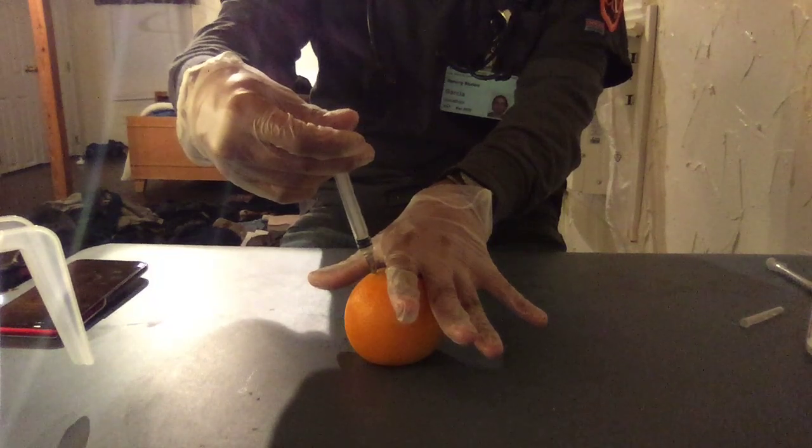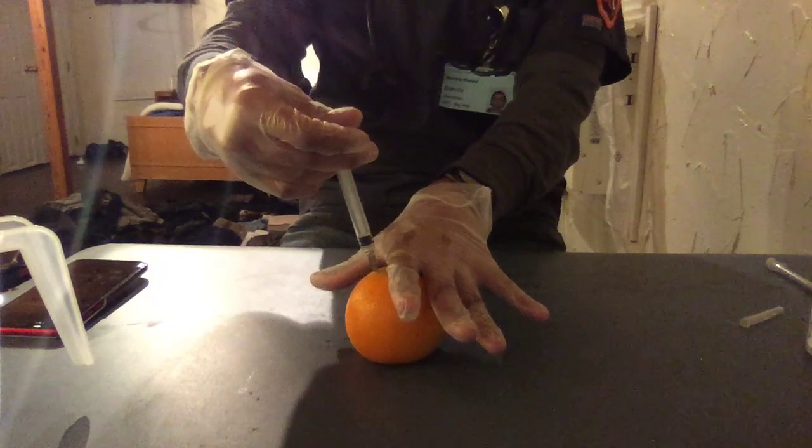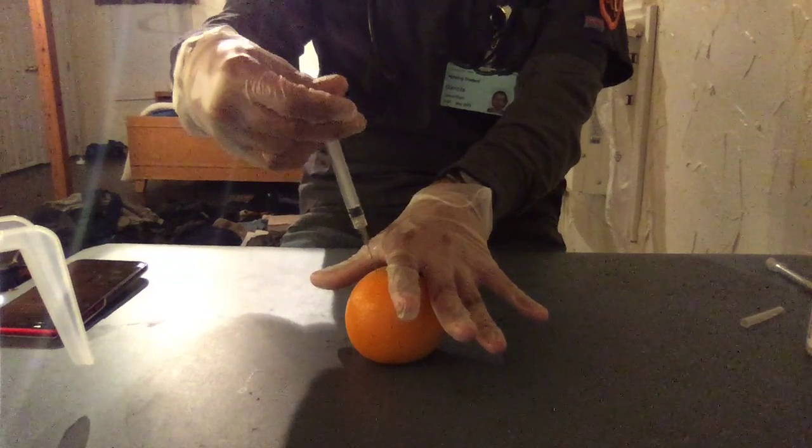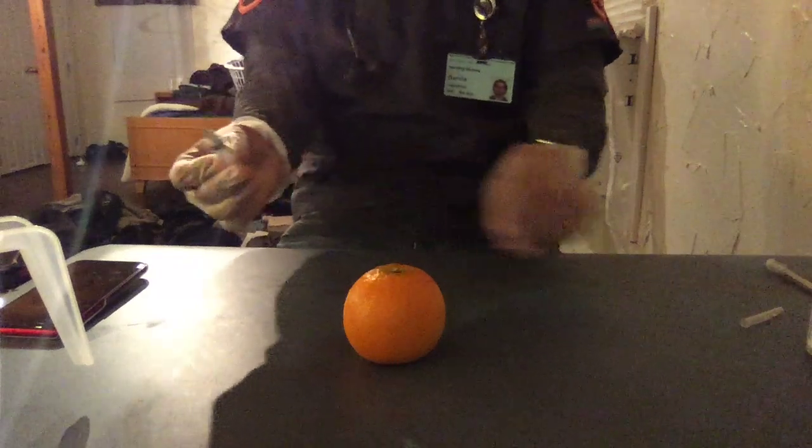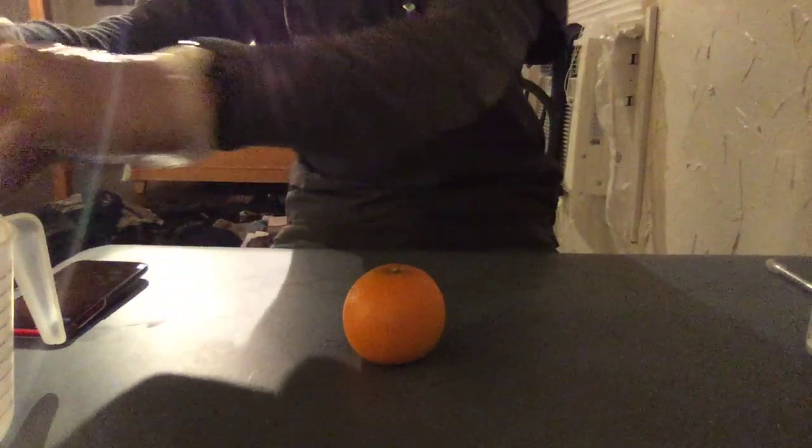Everything has to be in there. Leave the needle in there for a few seconds, about 10 seconds, to make sure everything's in there. Then bring the needle out nice and slow. Activate the safety on the needle, and then you throw it into the sharps container.